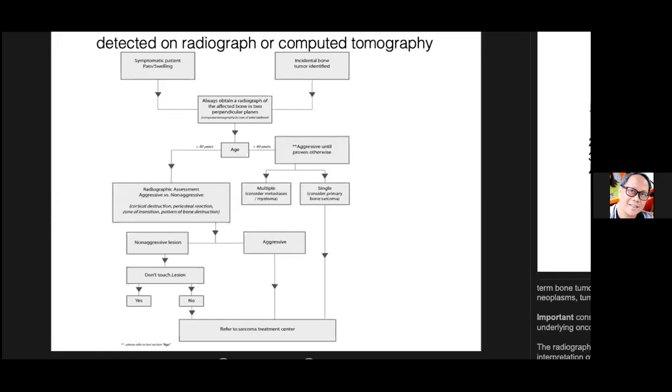So again, if you look at the modalities involved here, they basically make use of the same principles. X-ray makes use of radiation going through matter, and it shows you the same pattern of densities that you would appreciate also in computed tomography. The main advantage of computed tomography is that it's able to display a wider area, and also it can present the data in 3 or 4 dimensions, and you may do a lot of things that you can do with anything that is digitalized.